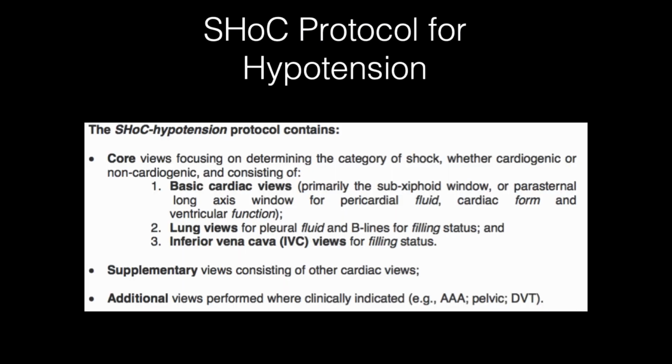In that consensus statement, they talk about core, supplementary, and additional views to get. And I like this approach because it allows me to use the minimum amount of time in ultrasound windows to get to the answer fastest. And I think this is appropriate.